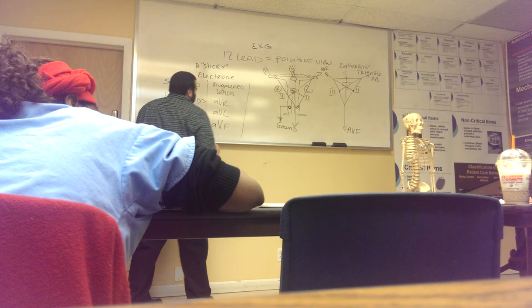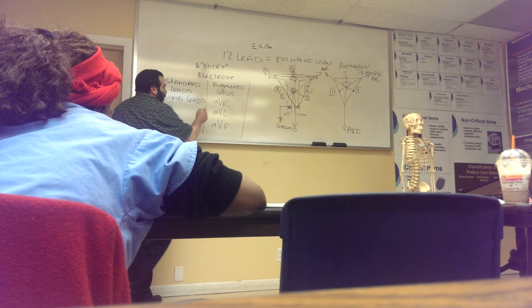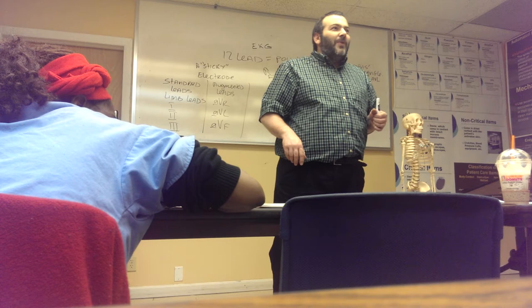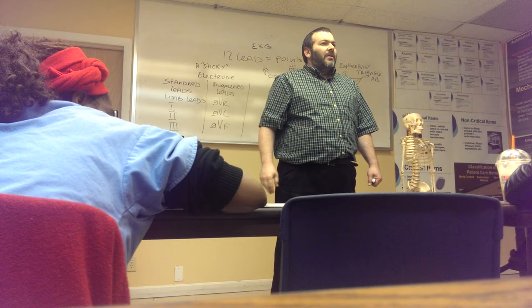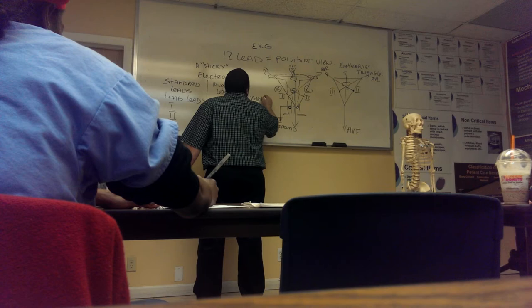What do you think A stands for? The answer's on the board. Augmented. Now, V must stand for something also. Since we're dealing with EKG, or electrocardiogram, we're dealing with electricity. When you talk about electricity and you see a letter V, what could we be talking about? Voltage. Excellent. Or power, amount of electrical power. So V stands for voltage. So now we're beginning to see a picture. A stands for augmented.